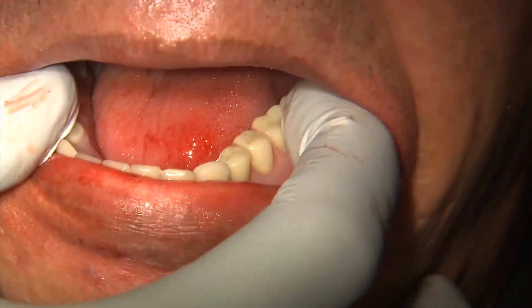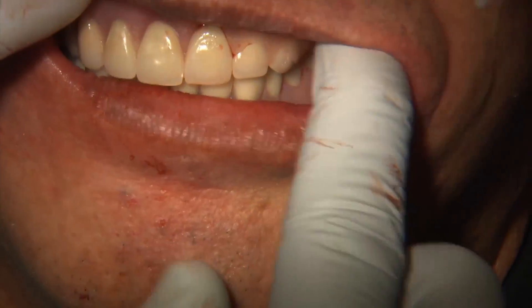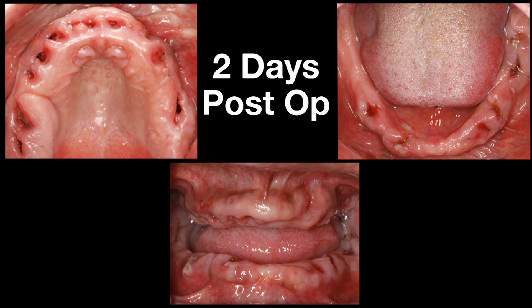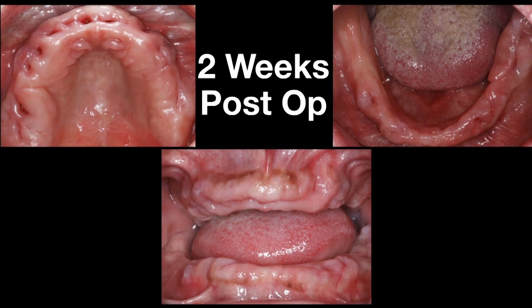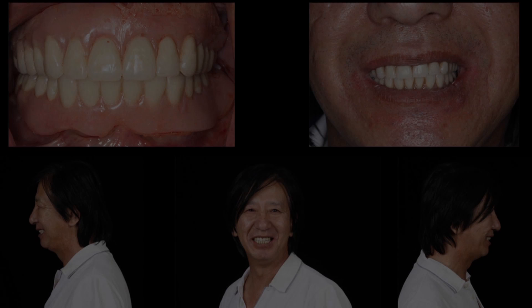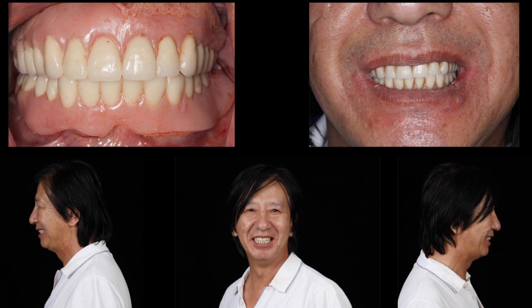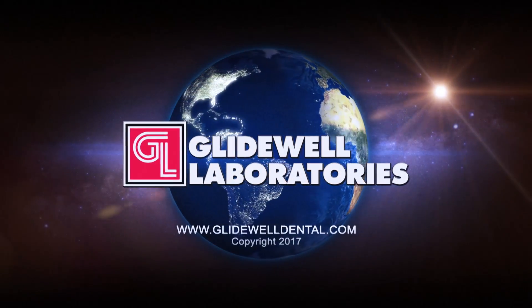The great thing about going digital is not really having to worry about extracting teeth during your preliminary impression when a patient presents with this type of situation, along with the fact that it's extremely fun to do this type of dentistry. The healing time was fairly quick — this is two days post-op, and here is a two-week post-op picture showing the extraction sockets healing fairly well. So there you have it: a digital denture fabricated and processed analog, with the option to mill the final denture. I hope you enjoyed this presentation. Thank you.